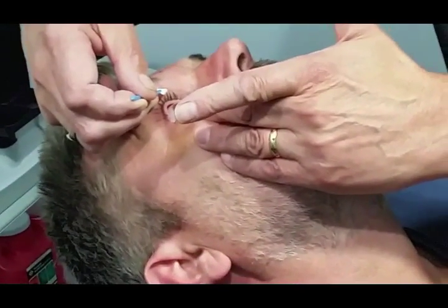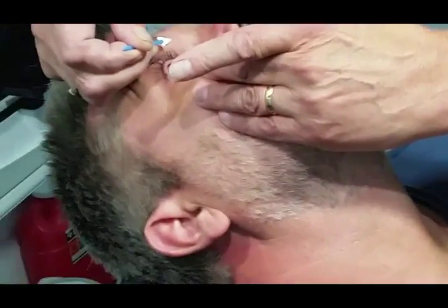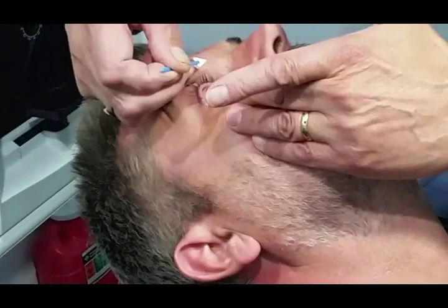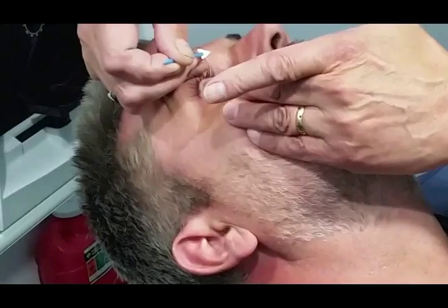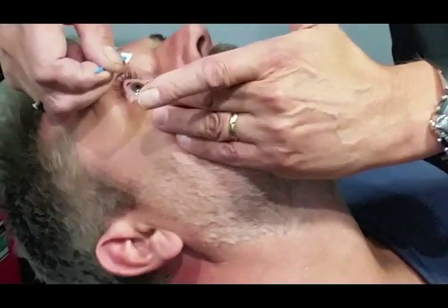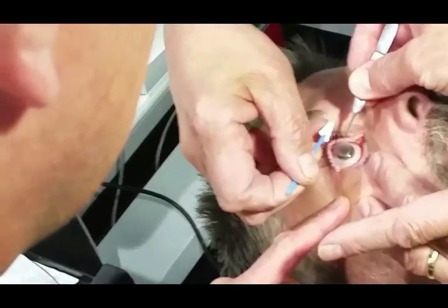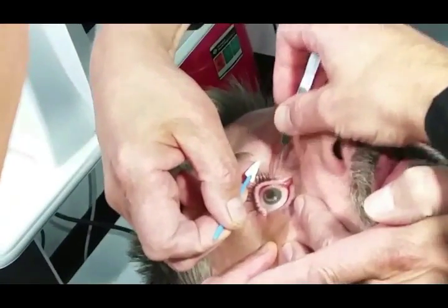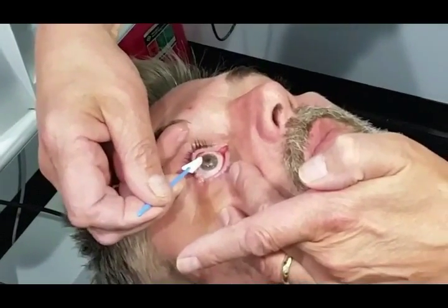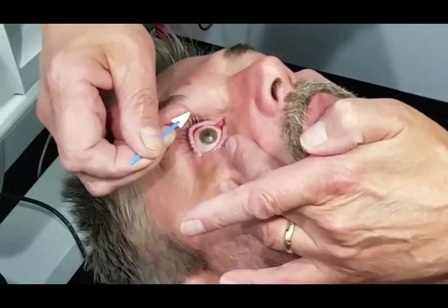I'm holding the lids back and my partner is going to dry the cornea and apply the amniotic graft. We're using a 10-millimeter amniotic graft. It's very important to dry the eye as best as possible. Here we're using forceps to apply the graft and then a Weck-cel sponge to dab it down, and again we're going to let it dry so that it does not move around underneath the contact lens.